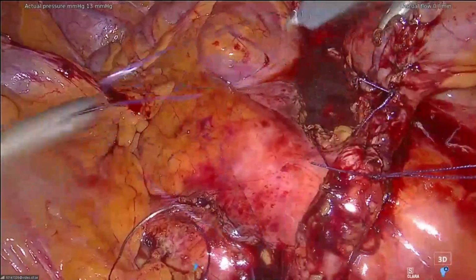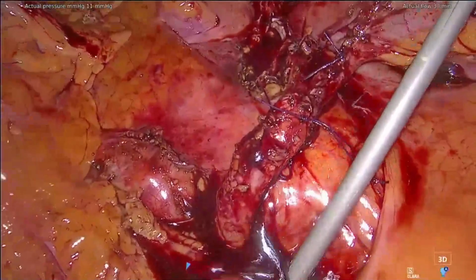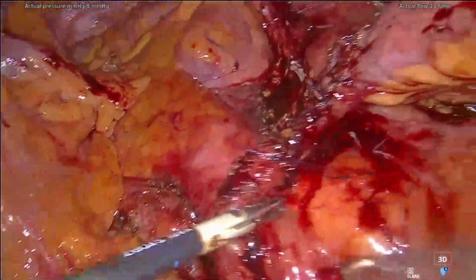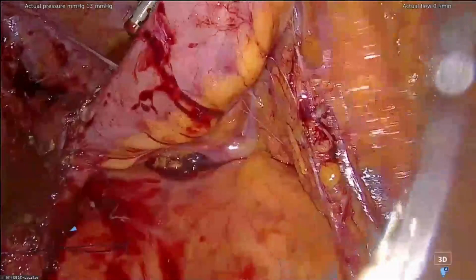Yeah, be careful, you have the 2 needles there. Okay, scissors and monofilament. And okay, now the repair is done. That's a good point. We have resected all the distal part of the ureter. It was a good point too. And now the question is how I can avoid having a problem there. Show me a little bit the meso, because the epiploon. Renaud, excuse me. Epiploon is there.